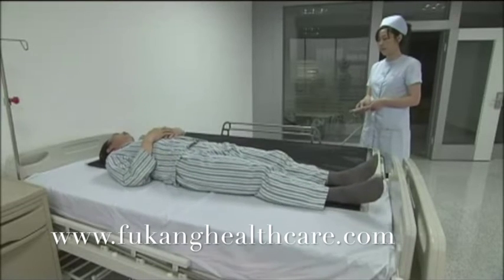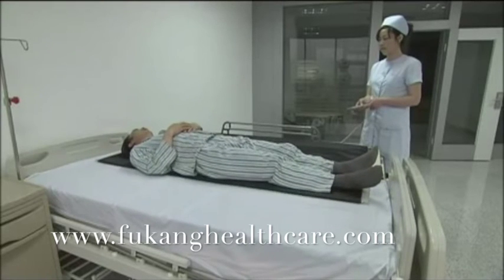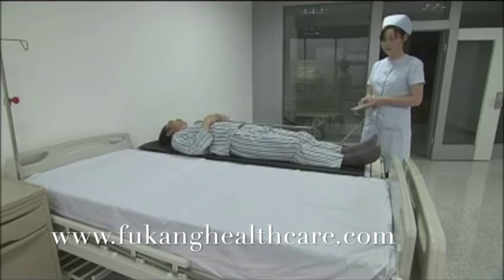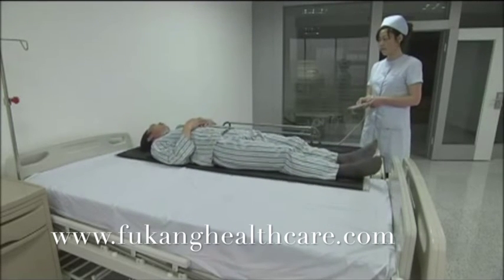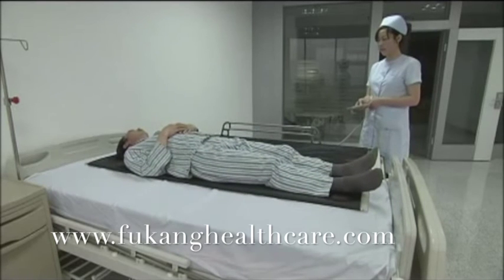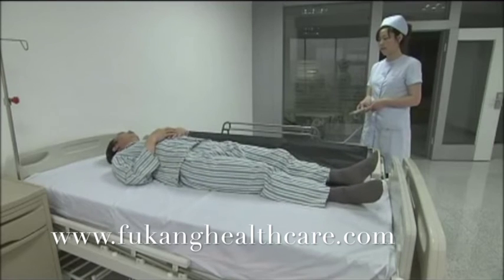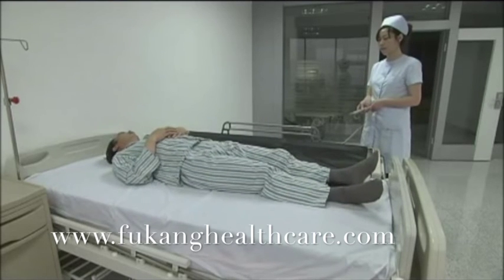The transfer device is used to transfer the patient automatically between the operation table and the device without any movement by the operator. It can effectively avoid causing any further injury to the patient, protecting the patient and reducing the operator's physical intervention during the transfer process.